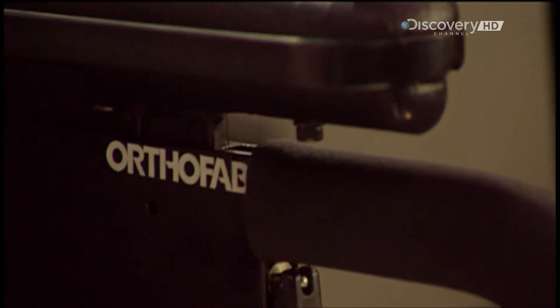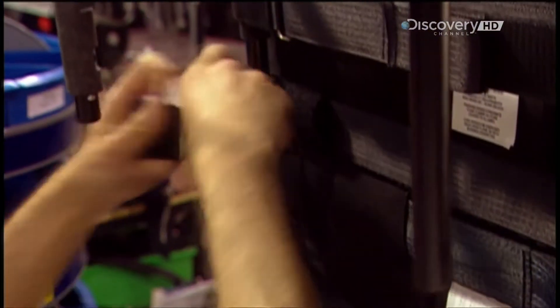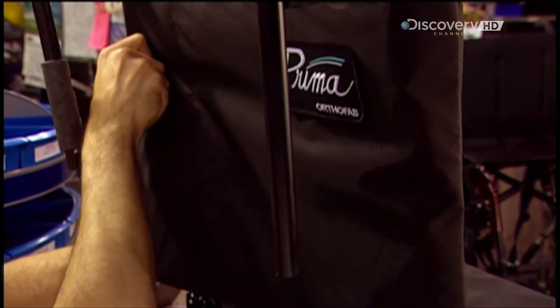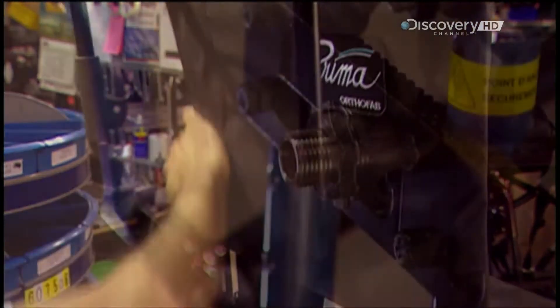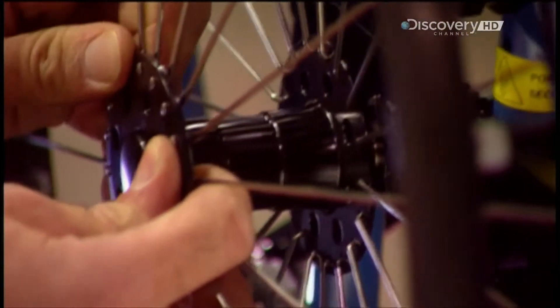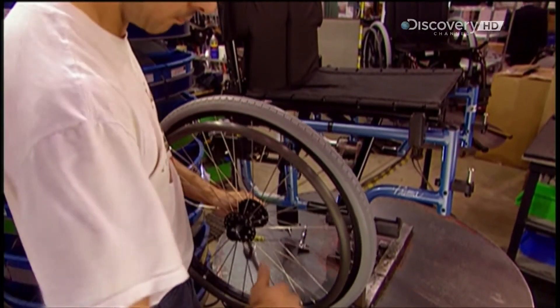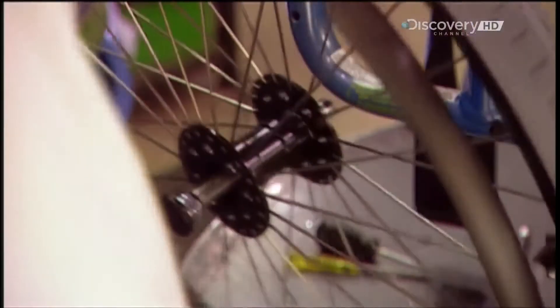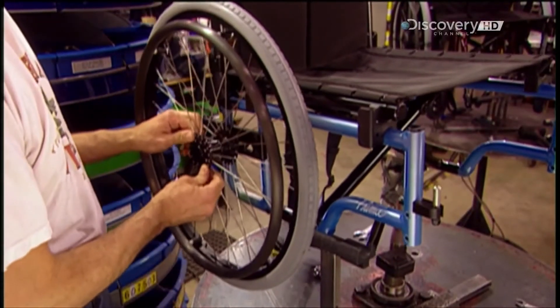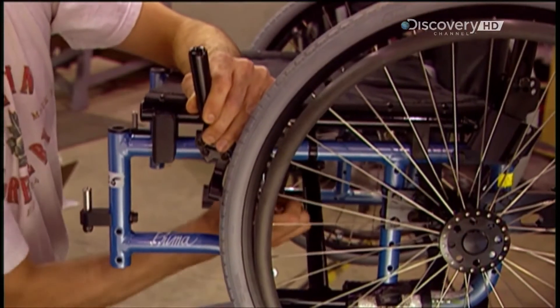You can adjust the armrest height from 20 to 28 centimetres, and the tension in the backrest with three Velcro straps. The backrest is also made of nylon and comes in nine different heights. Workers insert the wheel axle into the frame, adjusting it to fit with the optional features of the chair, such as a particular style of armrest. The axle has a quick release so you can remove the wheel in seconds. The plastic and aluminium hand lever is a parking brake.